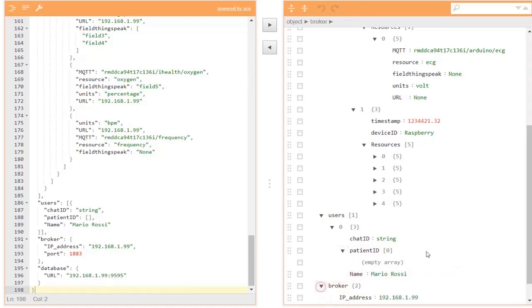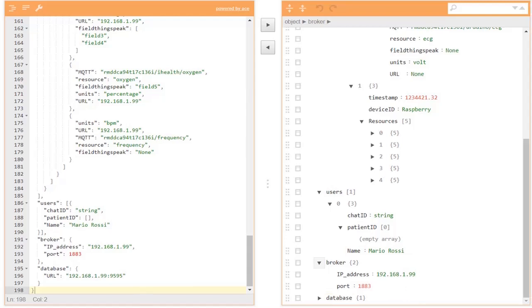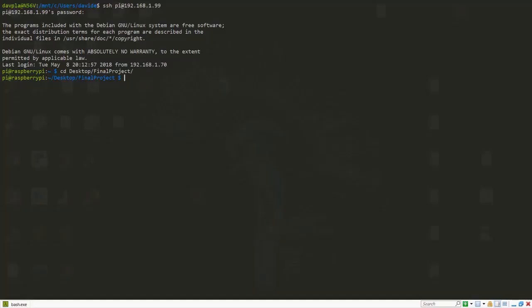Broker contains the information about the broker. It has an IP address and a port where all the devices that communicate to the broker via MQTT will connect. Database contains the URL of a database where are stored the ECG traces and the picture of the ECG traces. First of all, let's see how to add or delete a patient from the catalog.